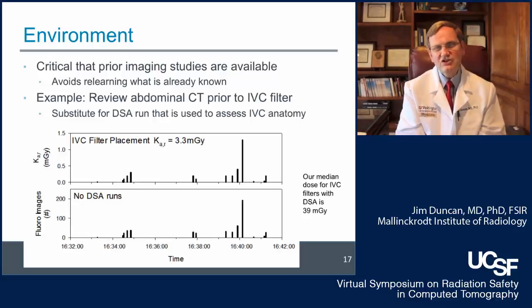And we decided we'd try that. And so here's a filter placement with 3.3 milligray. The 50th percentile for our filters is 39. So this is tenfold lower than a typical IVC filter placement.